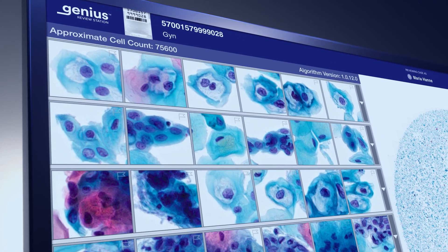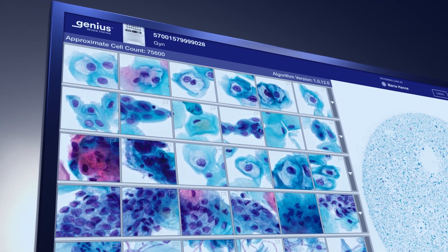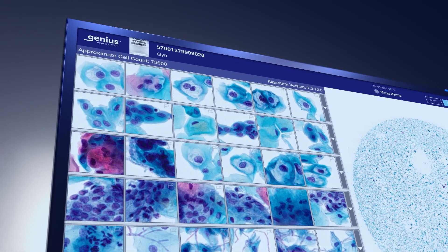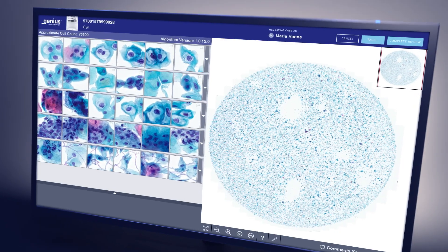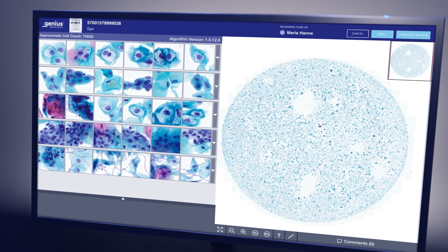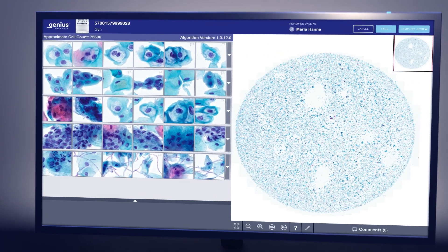To further streamline review, the algorithm provides an estimated cell count to assist in standardized adequacy determination and identifies glandular cells and infectious organisms.